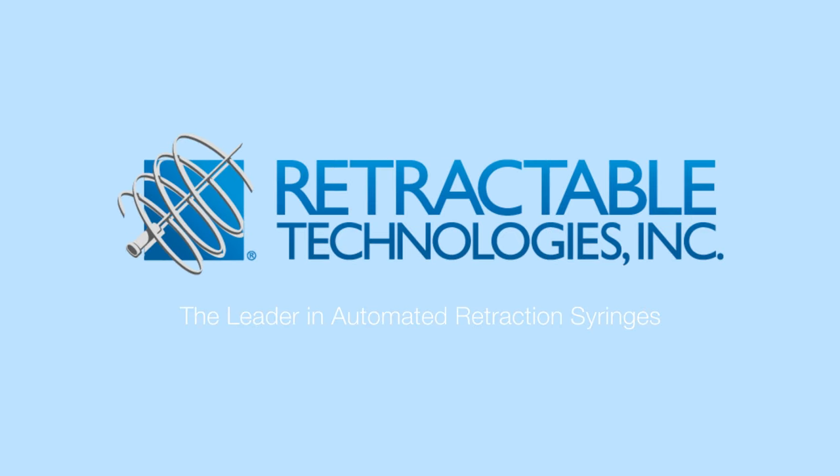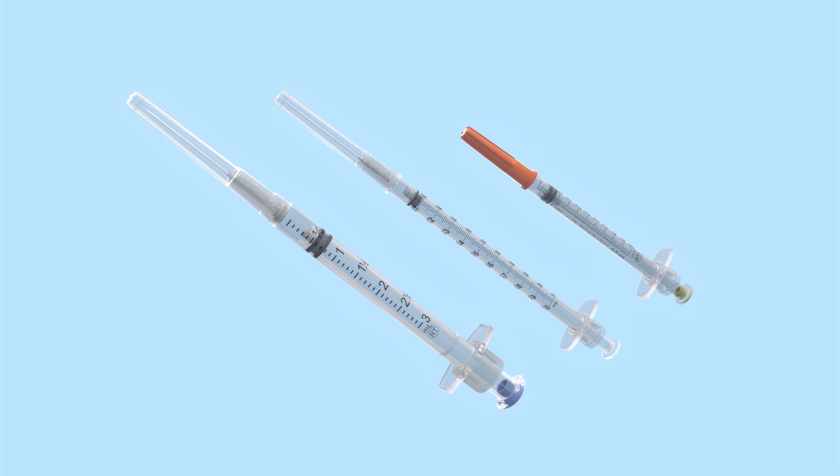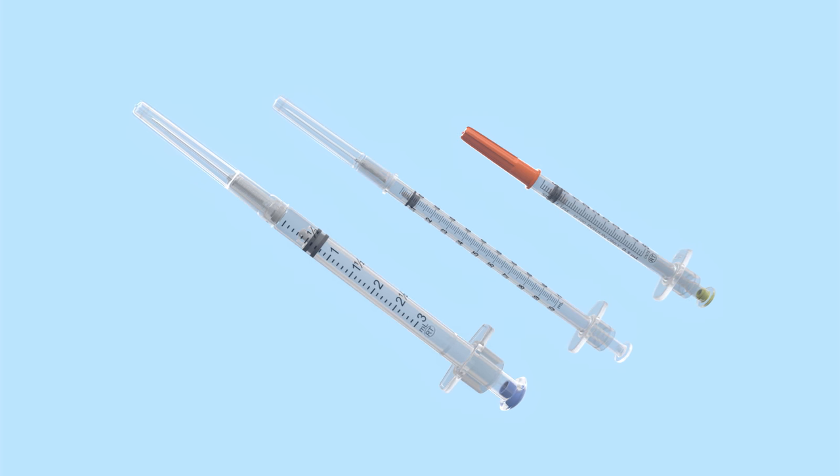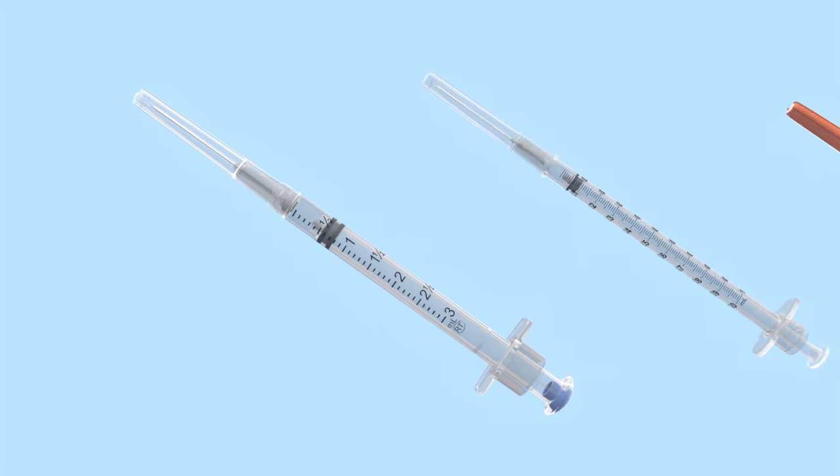Vanish Point Syringes from Retractable Technologies, the leader in automated retraction syringes. Vanish Point Syringes feature automated retraction technology that virtually eliminates exposure to contaminated needles and effectively reduces the risk of needle stick injuries.